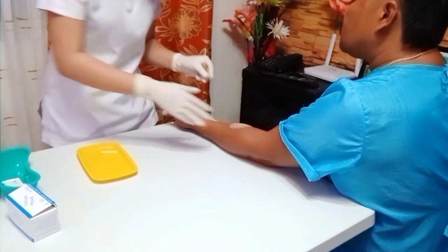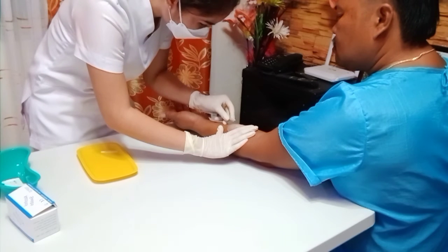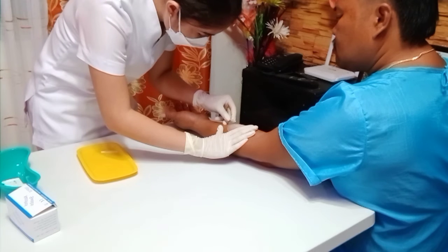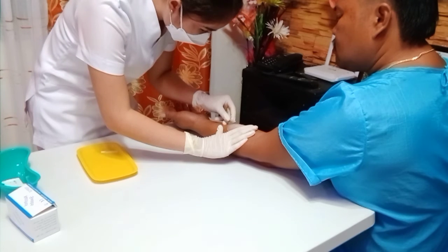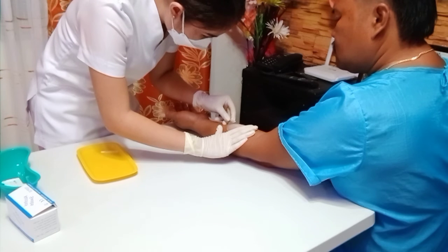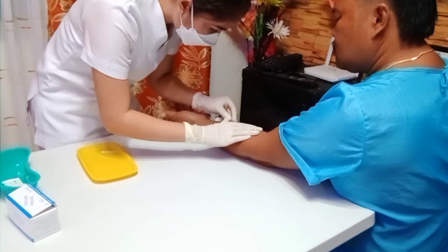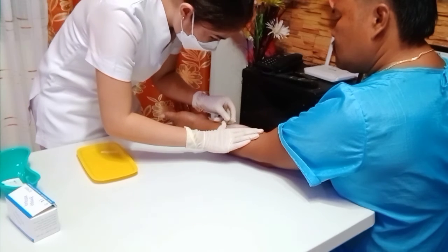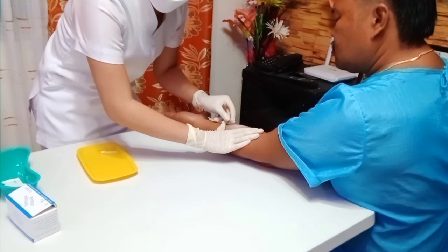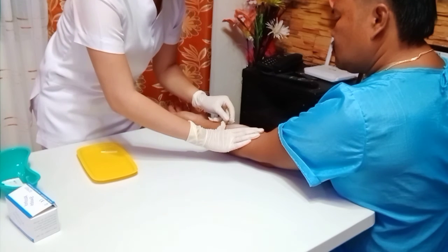Next is to hold the needle almost parallel to the skin with the bevel of the needle facing up. This prevents accidental needle stick and the inadvertent unscrewing of the needle from the barrel of the syringe. Next is to hold the patient's skin and pull tight until it is taut. This facilitates needle entry, which in turn minimizes the patient's discomfort.